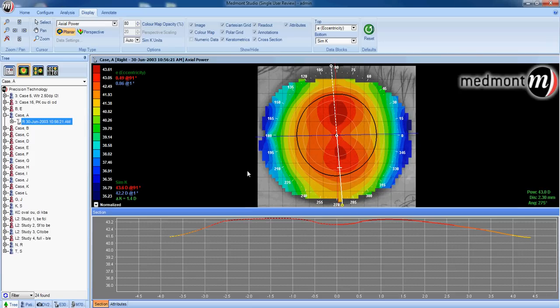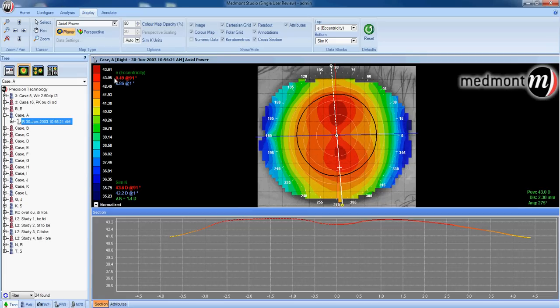If you select a topography that has much steeper curvature or much greater range of curvature, the scale will adjust for each individual patient eye. Normalized scale is the best way to interpret maps to get the best definition on each individual eye.